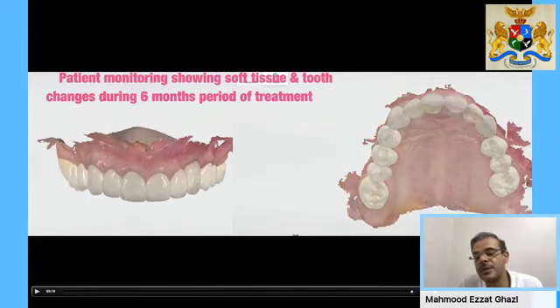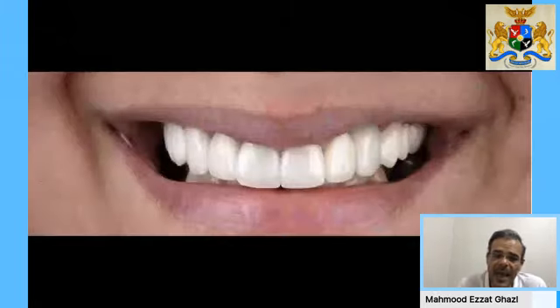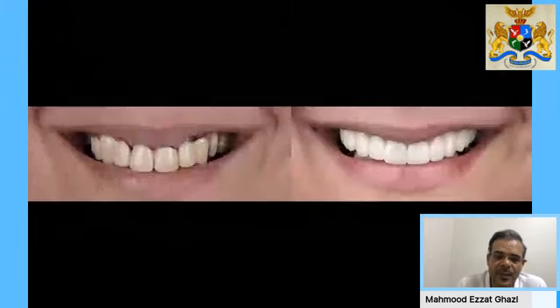So this is where it took most of our time, but we already had everything pre-planned. We already knew what we were expecting. So this was a phase where the patient was very patient with us. She was very happy when we used to see her every 2 to 3 weeks, and we would scan her once more and show her the differences and the progress that she had gone through. It got her very motivated with oral hygiene, because these types of cases need meticulous oral hygiene and patient compliance, of course. And again, these are the final results that we were able to give the patient.